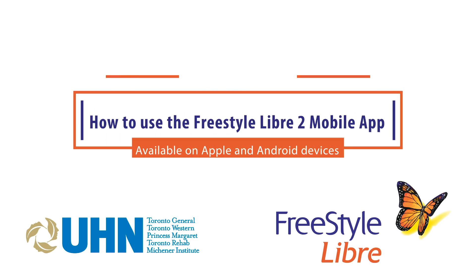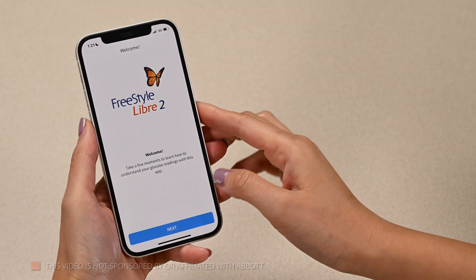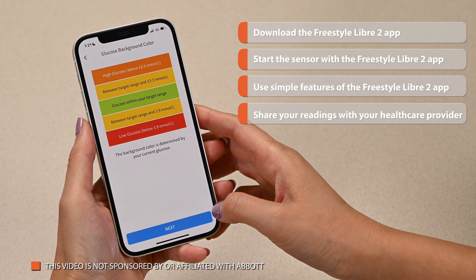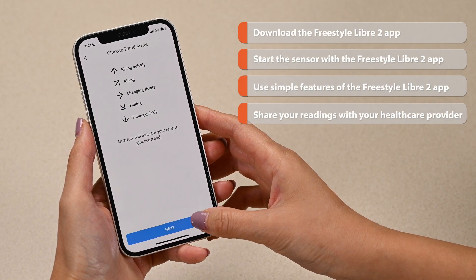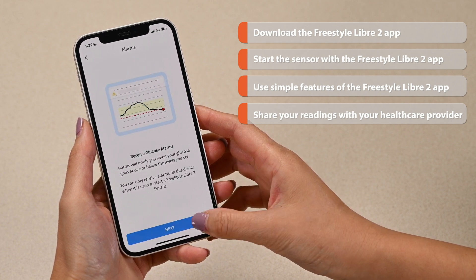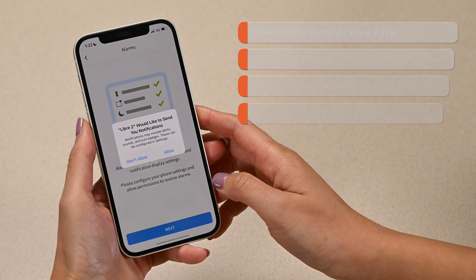In this video we will show you how to download and use some simple features of the Freestyle Libre2 mobile app. This video will show you how to download the Libre2 app, start the Libre2 sensor with your Libre2 app, use simple features, and share your glucose readings to your healthcare provider or clinic.